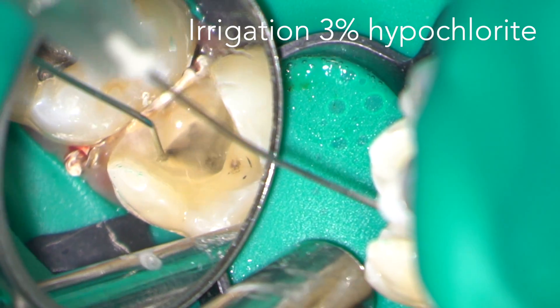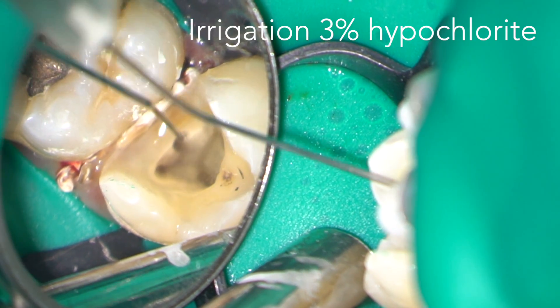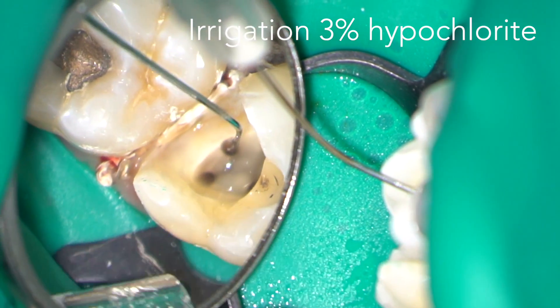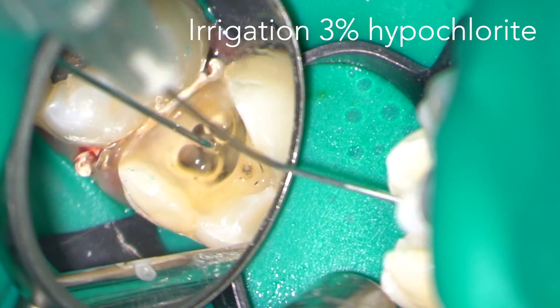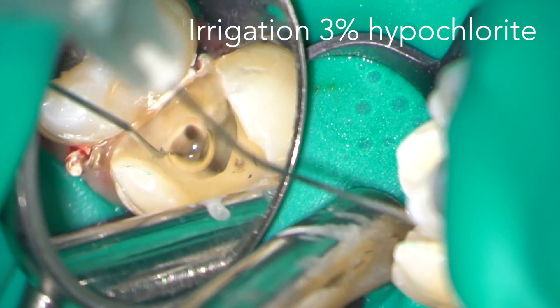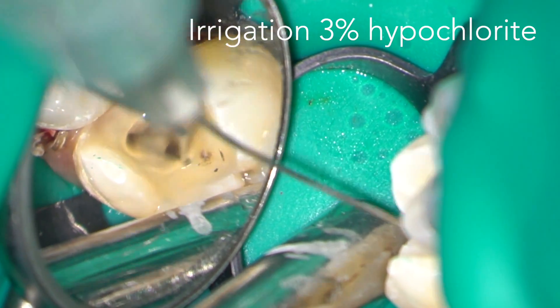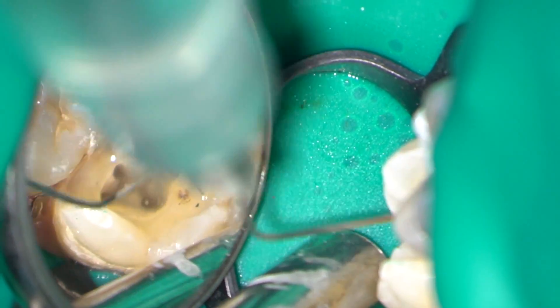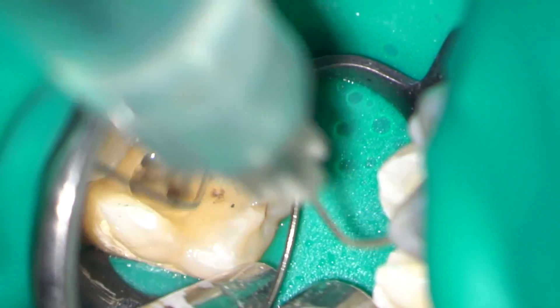And now the key to successful endodontics: sodium hypochlorite. Here I'm using a 3% solution in a safe-ended needle that has been pre-bent short of the working length. These are all measures to avoid extrusion of irrigant.